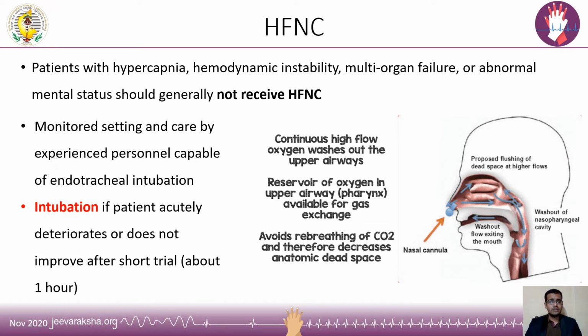What you will have to know is, when you're doing this high flow oxygen supply to the patient, you will have to keep ready the crash cart, as I told, because the high flow nasal cannula or NIV is given to a patient who is going to be in respiratory distress at the initial time. So you're going to give a trial of these devices. If it is not working in about 1 or 2 hours, you don't overtry this. You will quickly have to get ready and intubate this patient. So you will have to be very vigilant in such patients, and you will have to have experts around you when you are handling such patients.